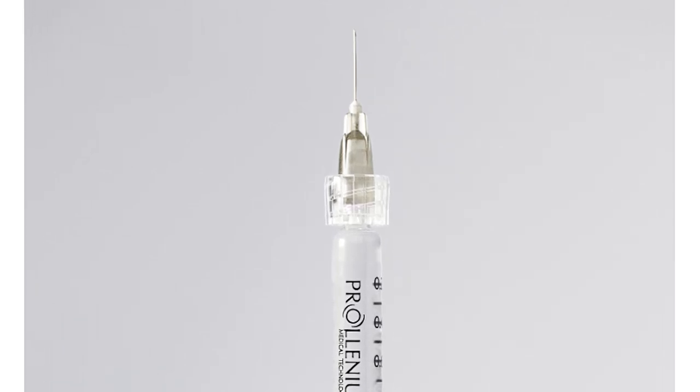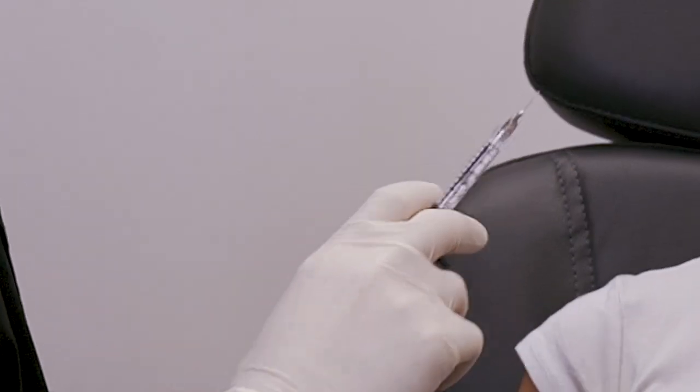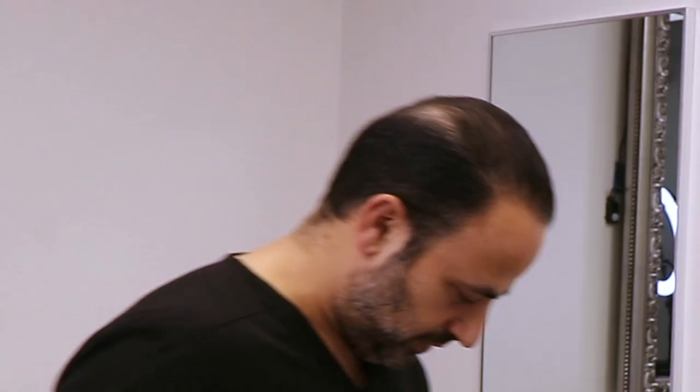You can always switch out the needle. When you do this, always prime your own needle — don't let anyone else prime it for you. You have to feel the pressure that it takes to push it out every single time. You have to relearn it, so don't let someone prep it for you.